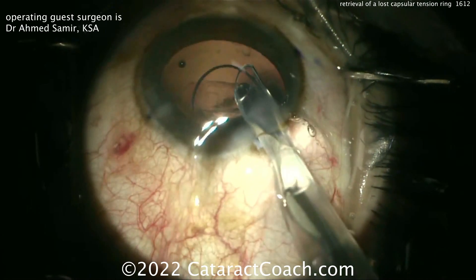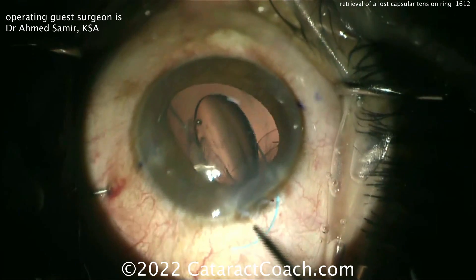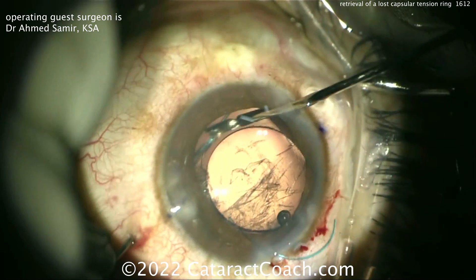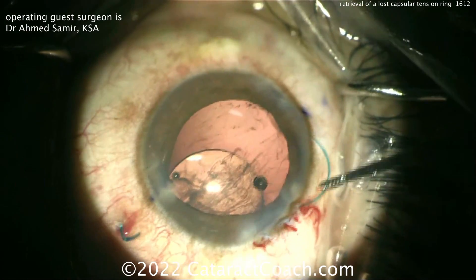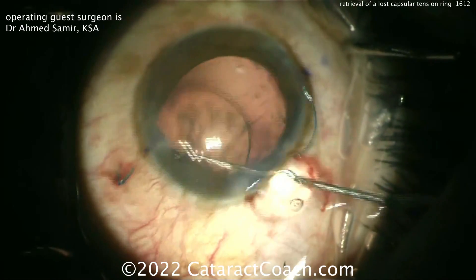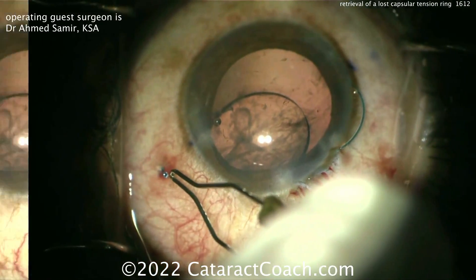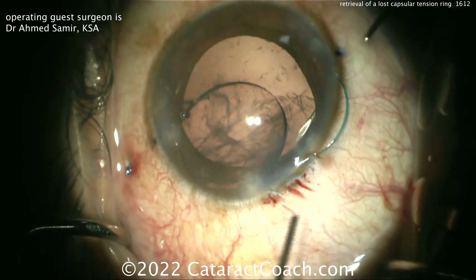Now going in again — here comes a three-piece IOL being very carefully placed into the capsular bag. Remember the 7L rule: the leading haptic should look like the number 7, and the trailing haptic should look like the capital letter L. Now it looks like a Yamane technique being done here, with one haptic being pulled through the sclera. I'm watching this video for the first time with you. So it looks like a Yamane intrascleral haptic fixation technique, with the other haptic being pulled through too.